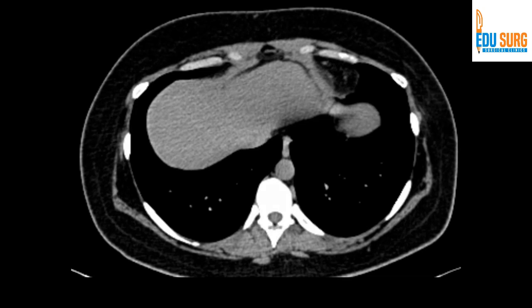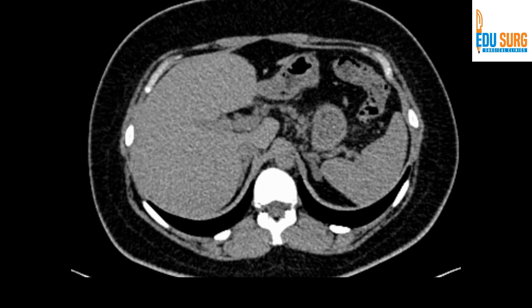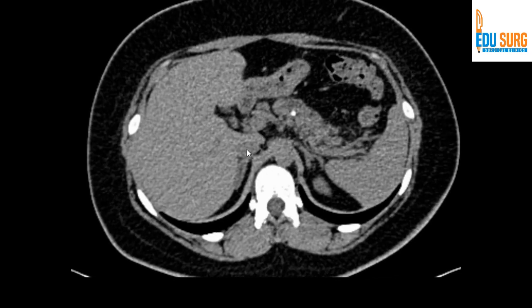Welcome to the CT console. This is the first phase of the pancreas protocol — the non-contrast or pre-contrast plain CT scan. This is identifiable as a CT scan because the bone is white: the ribs and vertebra appear as white structures. The aorta is not as white as the vertebra, nor is the vena cava — confirming this is a plain scan with no IV contrast.